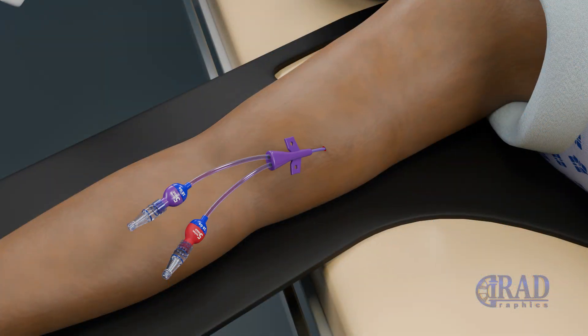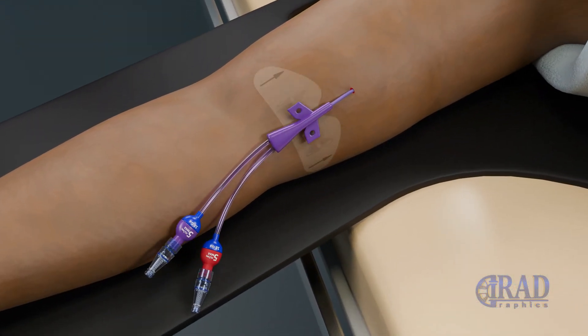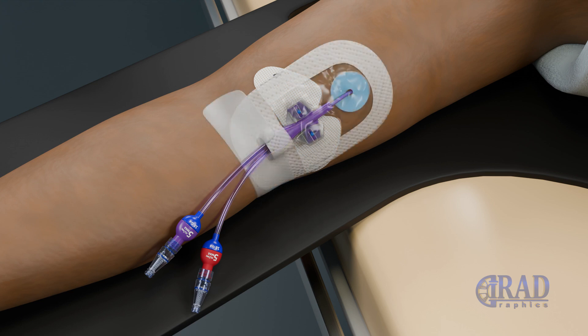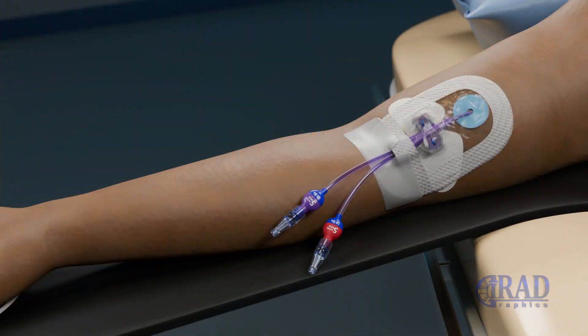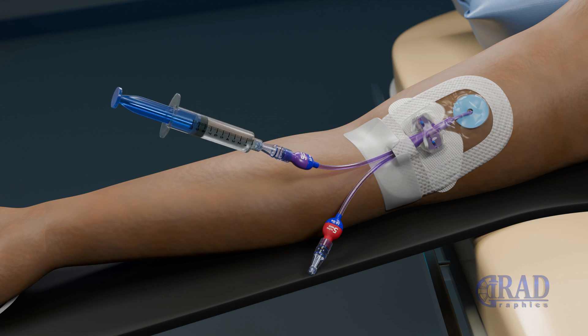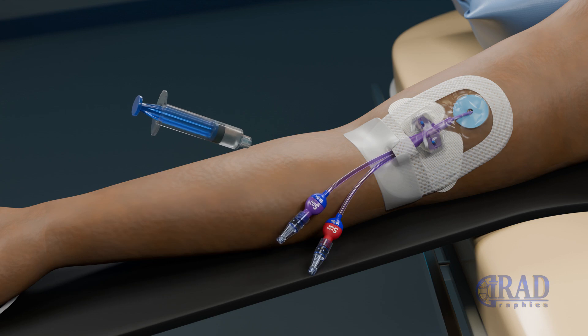The catheter is secured to the skin at the entry site using StatLock. Finally, sterile dressing is applied at the catheter's entry site and the catheter is then flushed. With the procedure complete, the PICC line is now ready for long-term use, providing safe and reliable central venous access for patients requiring ongoing infusion therapy and blood sample withdrawal.